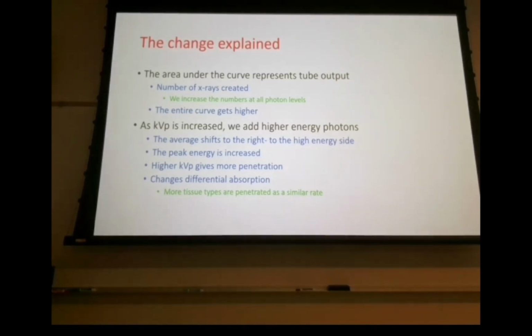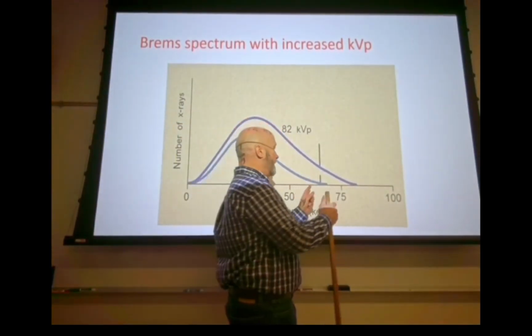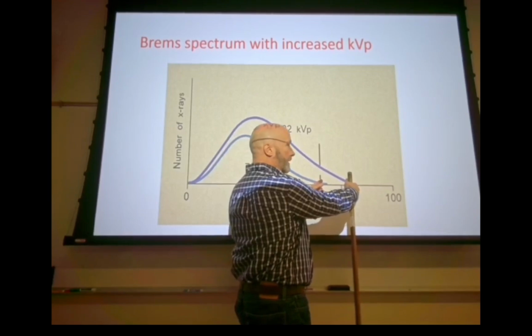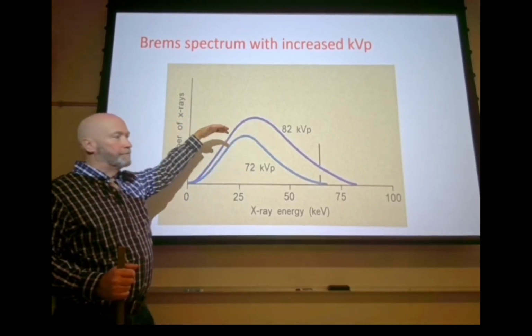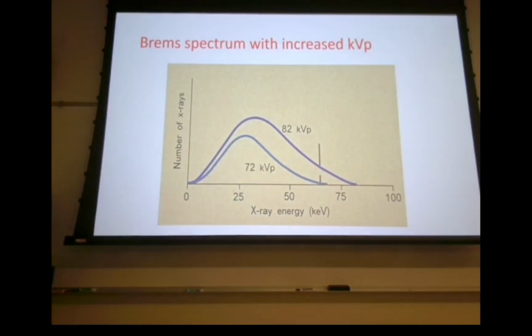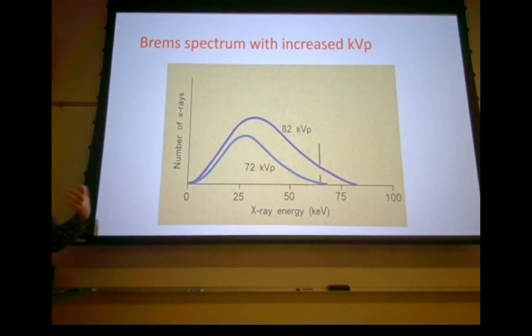On a superficial level, we have a tendency to think, okay, I increased my kVp, and what I increased was from here to here. Oh no, not even close. What we increased was from here to here, but we also increased all of that. So we got a tremendous increase in numbers, plus we got more penetration. Everything goes up. Increased numbers means you increase the average, which means you increase penetration. Well, the peak, mainly the average, but yes. All of that is touched by kVp.